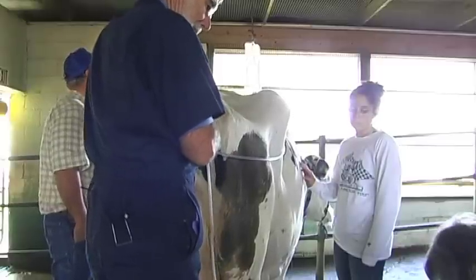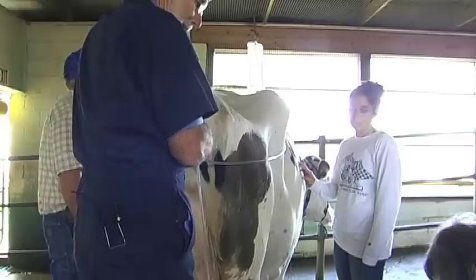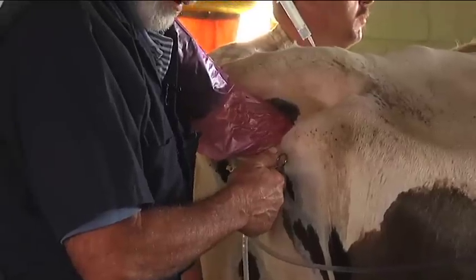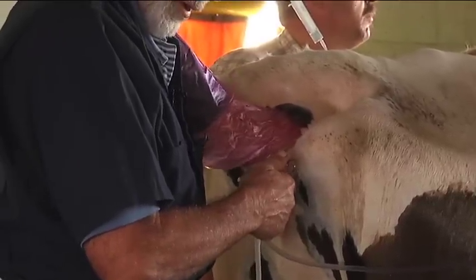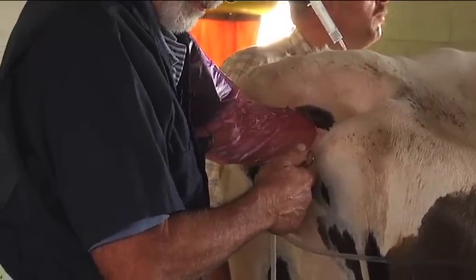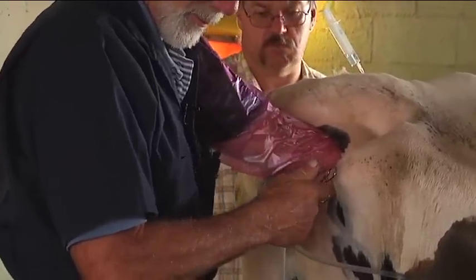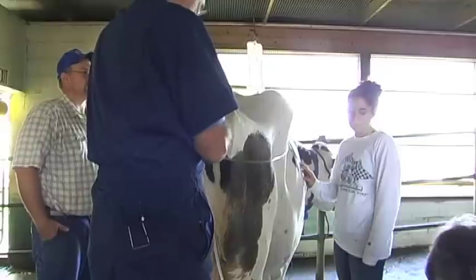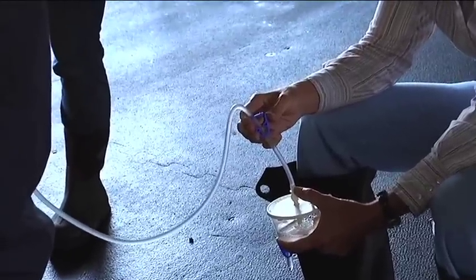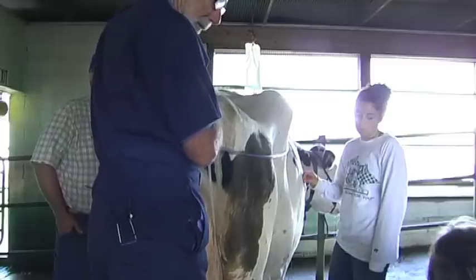The embryos at this point, which is day seven after breeding, are in the anterior portion of each horn. The aim is to wash those embryos out of the uterus. Approximately 25 to 50 cc's of fluid is collected for examination under the microscope.